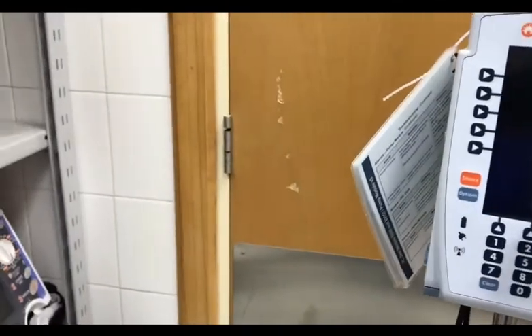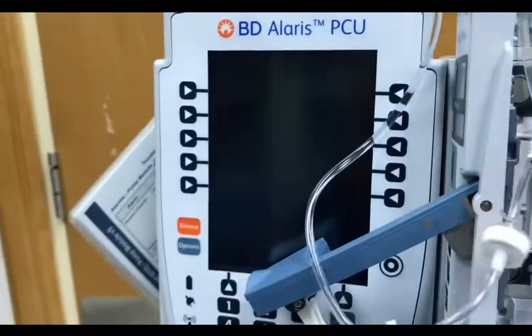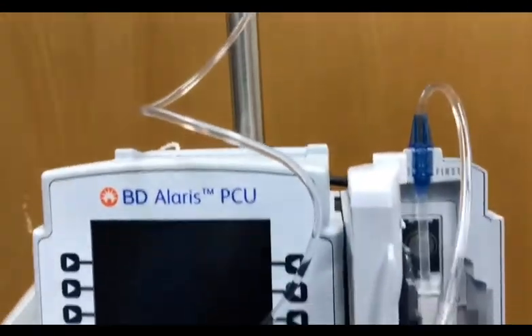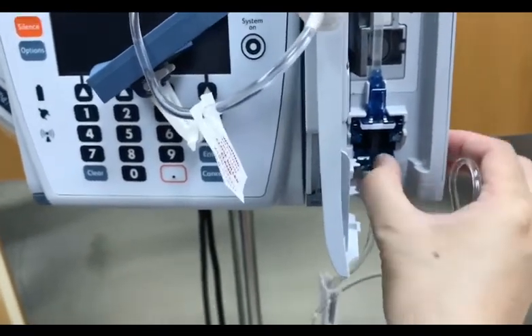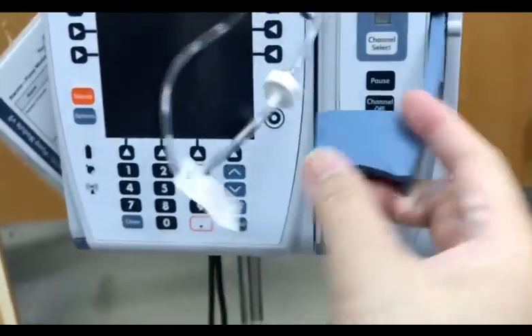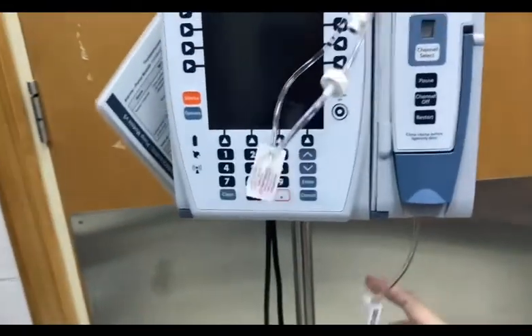Make sure this is the step one. It says here, load first. You can see this one here, load first. So this is the number one. After the priming, do the number one, and then this is the number two. At the bottom is the number two. Click and press a little para mag-fit in siya, and then you can now clamp the door. So, ayan. Click. So, it's now closed.